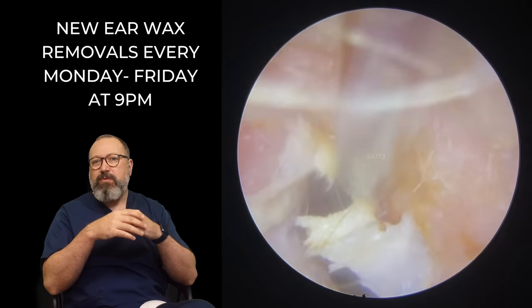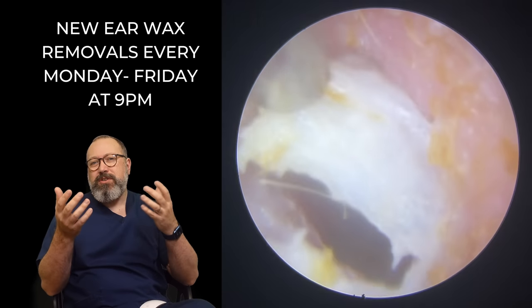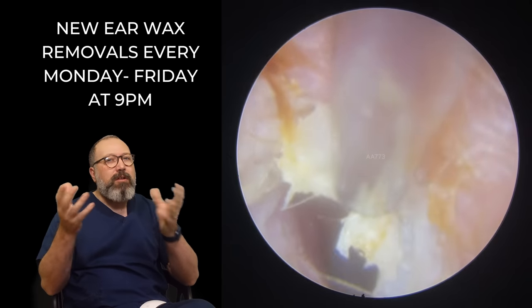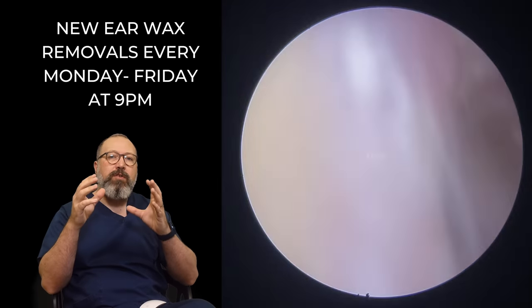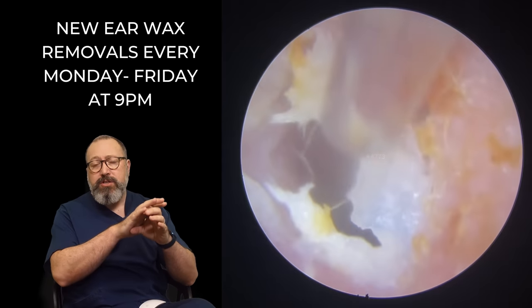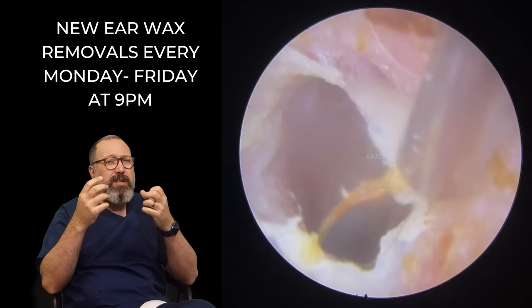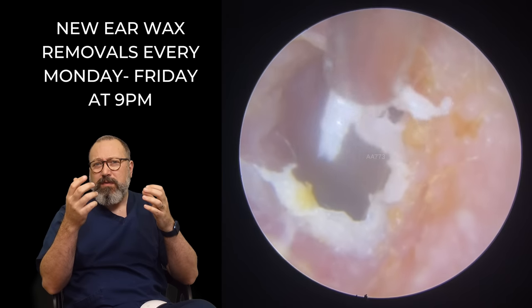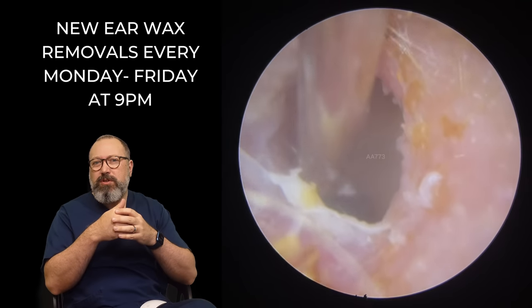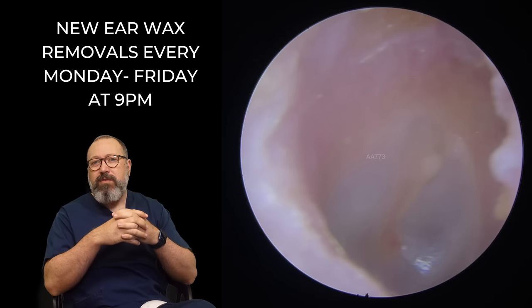So what we're doing here is just removing this. We've switched down to the fine end tube. The reason we're switching down is we're taking a lot of skin away — it's very soft, very floppy — so we don't want any clarinetting. If you're new to the channel, clarinetting sometimes happens when skin gets sucked inside the standard size tube, it vibrates up and down really quickly and causes quite a high-pitched, loud shrill whistle in the ear, which can be quite uncomfortable for the patient. So we always try to minimise that, and that's when we use the smaller tube — less chance of it vibrating and causing issues.